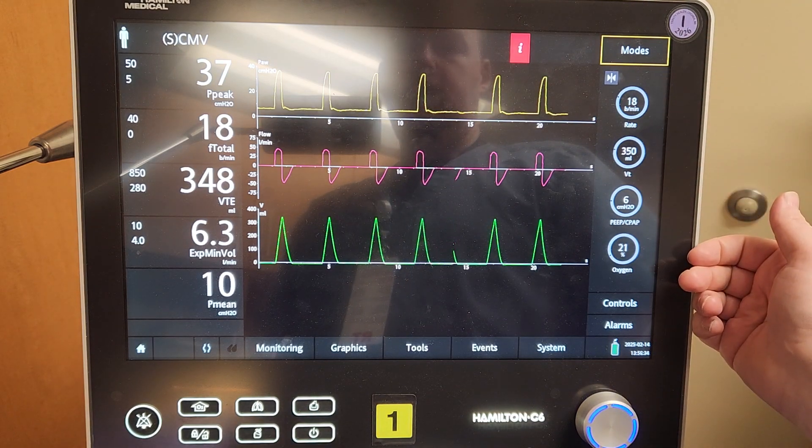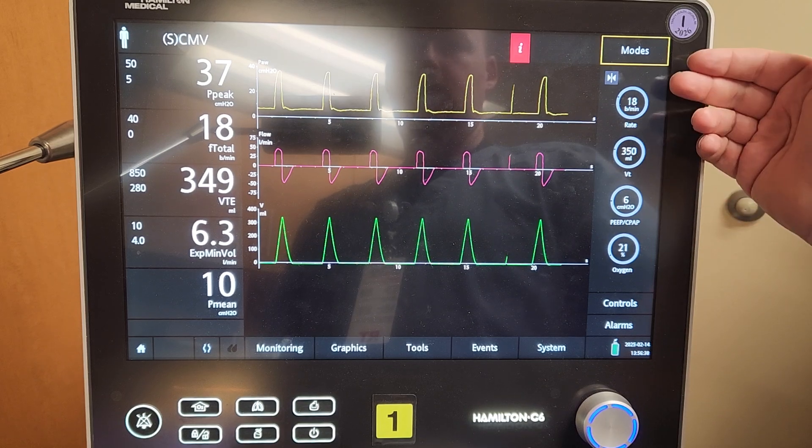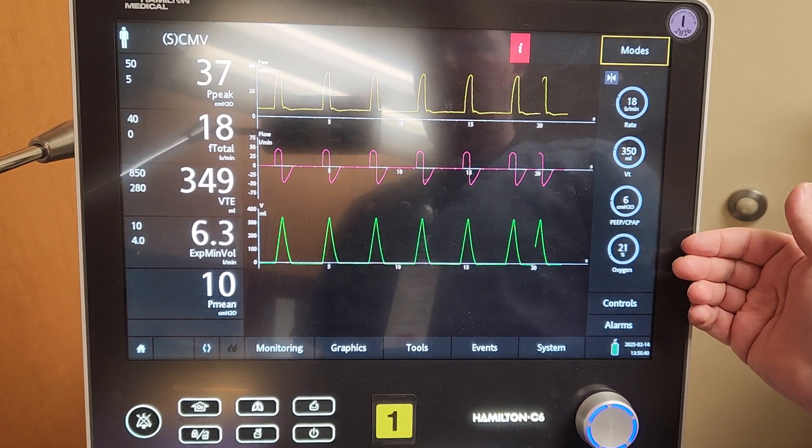Off to the right are your most commonly needed settings: rate, volume, PEEP, and oxygen.